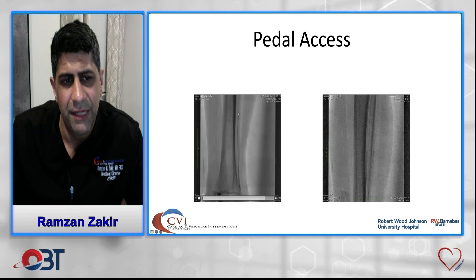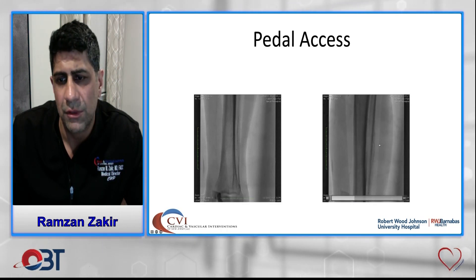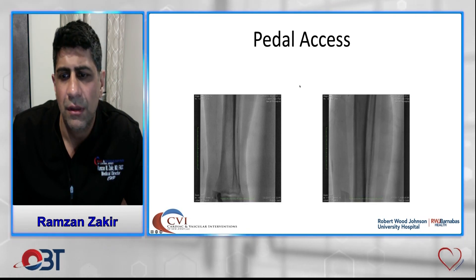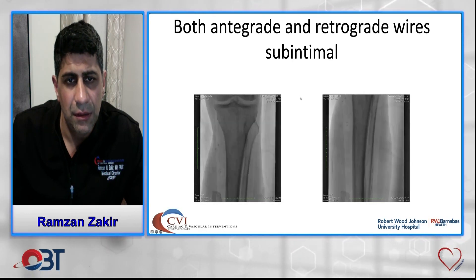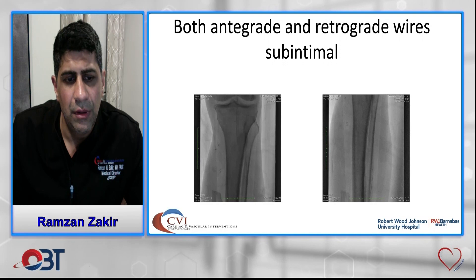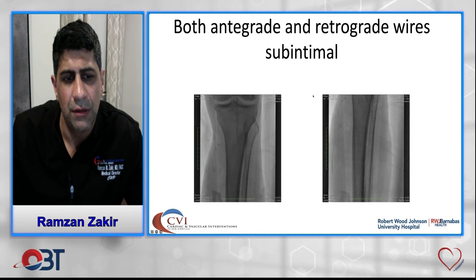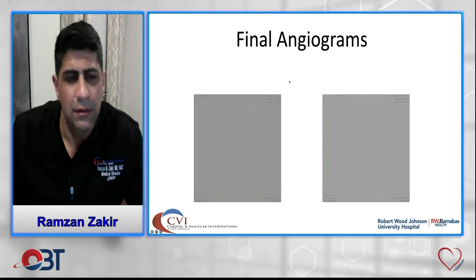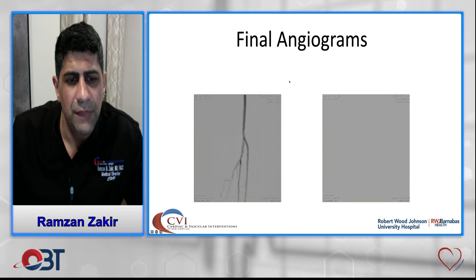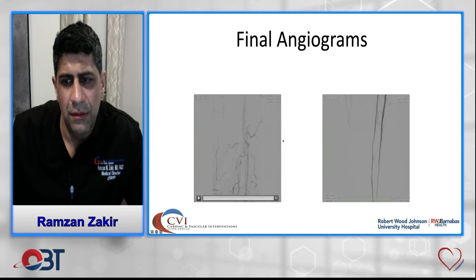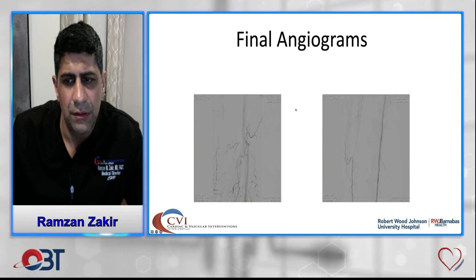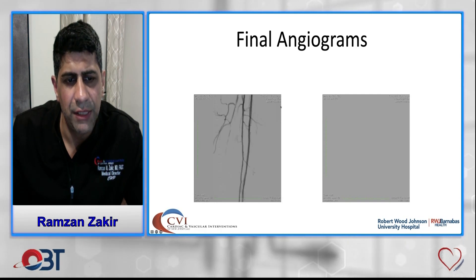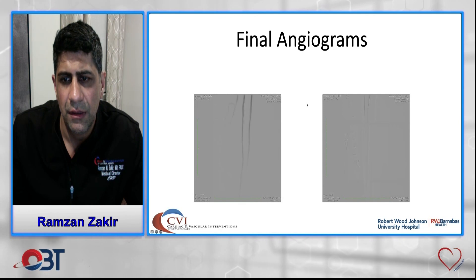Due to heavy calcium, the wire was unable to remain in the true lumen and went subintimal. With wires in both subintimal planes, we performed a reverse CART technique to redirect the wire into the true lumen. The final angiogram shows the anterior tibial artery looks great. This was achieved with PTA and drug-eluting stents placed in the anterior tibial artery.